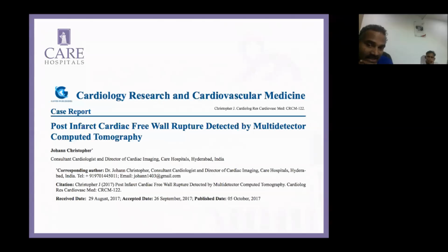And we did CT again. We could see a kind of nipple at the apex. MRI, we couldn't see anything. We could see the clot inside the wall. The wall appeared as if there is something inside the wall. I'll show you those images. I'll send them.